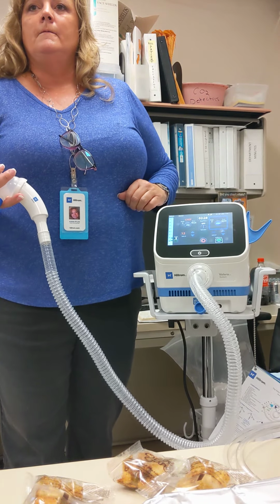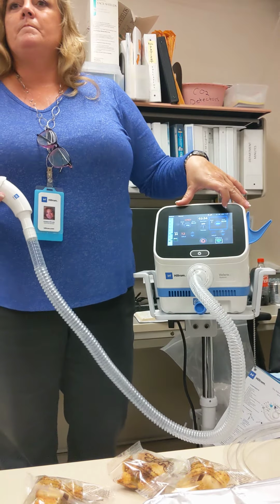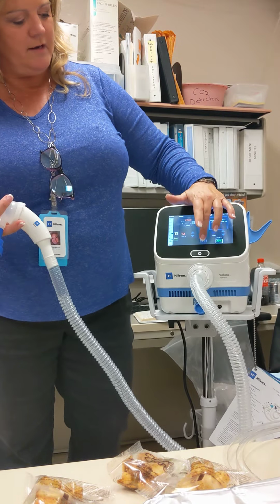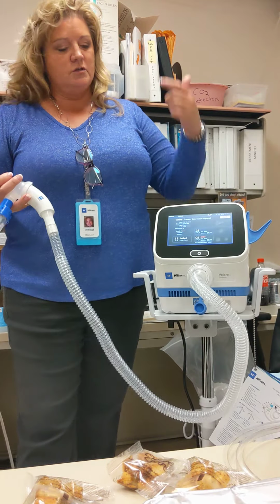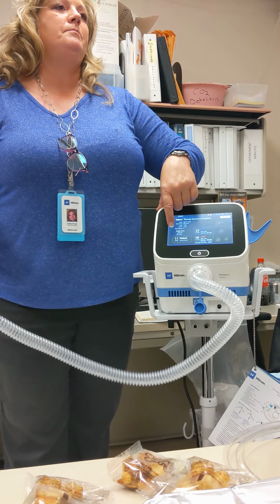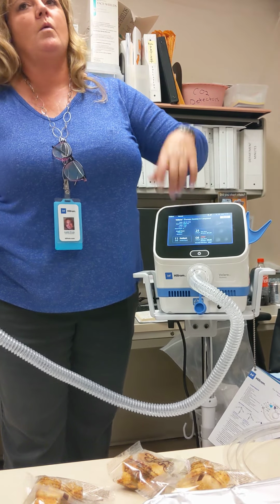Once again, we're looking at technique. We're looking at good chest wiggle. You're looking at their saturations. One thing we do not have on here is what if they start coughing. Then you're going to have to hit stop. There's no pause on manual. Let them cough it out. Just remember what your time was and go back. At the end, if you use 70% of a 10-minute treatment, so 7 minutes of a 10-minute treatment, it will count. Why do we have that?